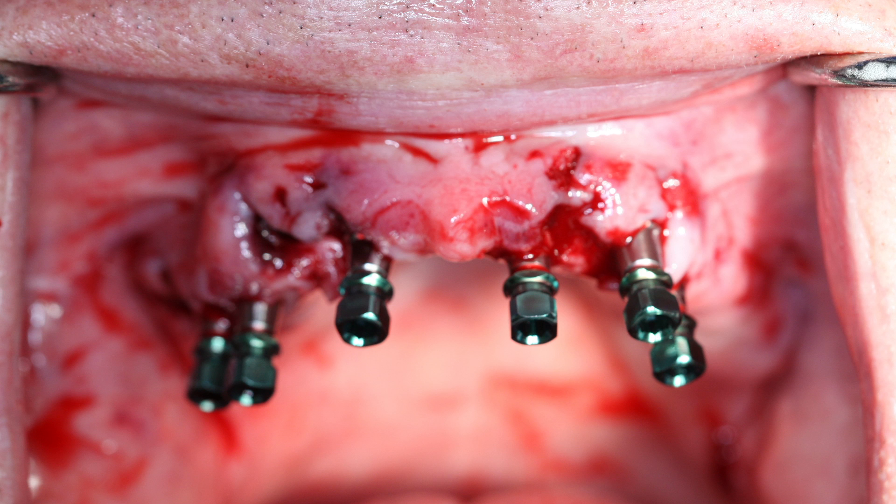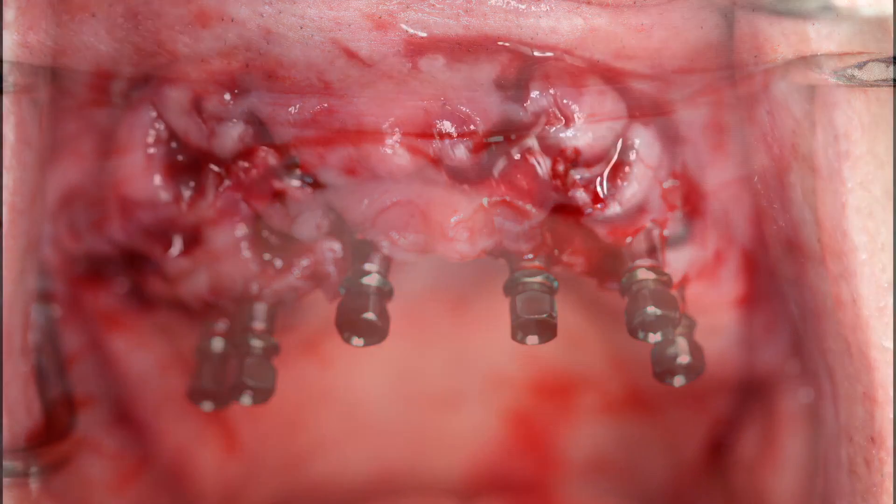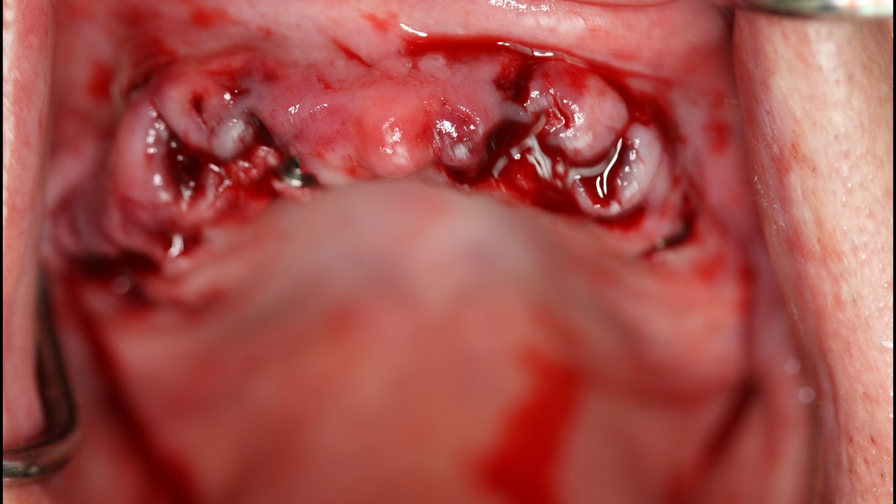With the treatment plan finalized, the patient was called in for surgical placement of the implants. A sequence of drills was used to create the osteotomies through keys inserted in the sleeves of the surgical guide. Six Legacy 3 dental implants from Implant Direct were placed in the precise position called for by the treatment plan, as illustrated in Figure 6. Figure 7 shows that the implant sites are sutured closed with the surgical placement complete. Healing abutments were seated, and a conventional denture was fabricated for the patient to wear during the healing phase, as immediate seating of a fixed appliance was contraindicated due to insufficient primary stability.